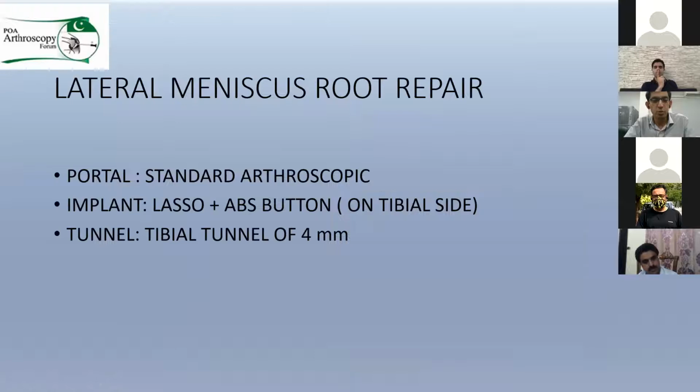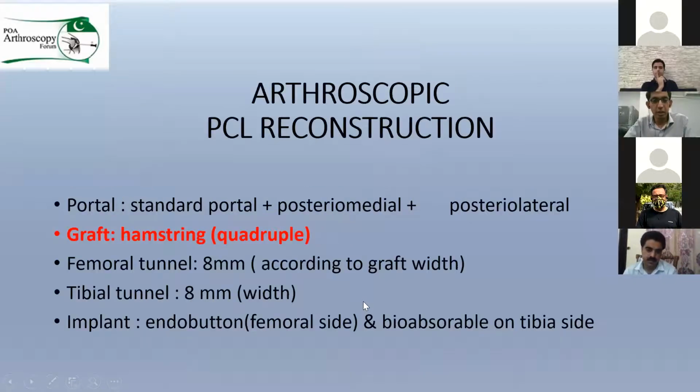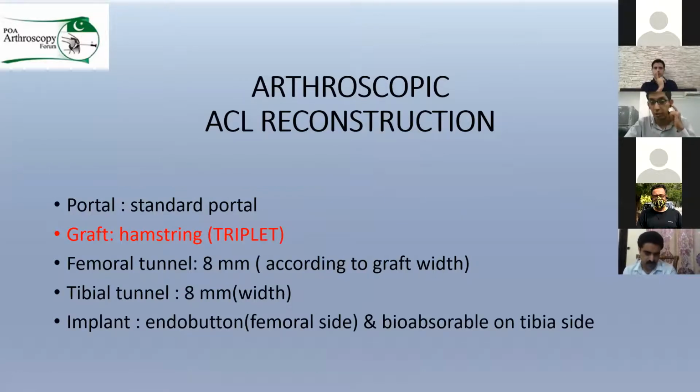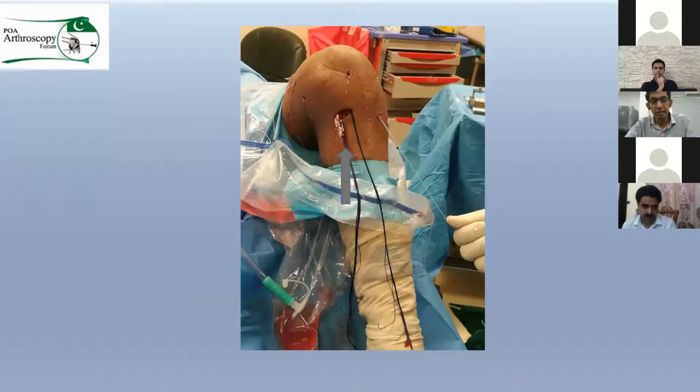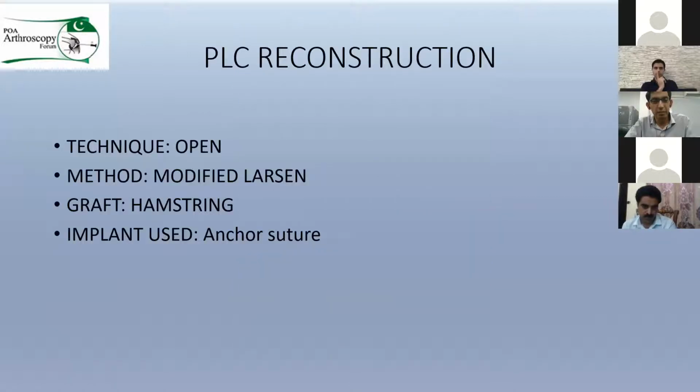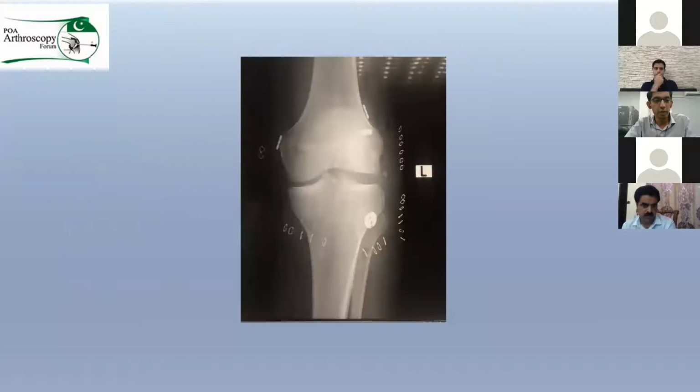So we planned to do the root avulsion fixation first using a lasso, and we used a button outside the patient. We did the PCL with the hamstring quadruple graft, and we did the ACL with a triplet graft because, given the thickness of the tendon, we were lucky to find a good thick tendon. Then these are the tunnels in C. We used divergent tunnels for the PCL. This is fiber wire for the posterior root avulsion fixation. And for the PLC, we again used the Larson loop technique because of the graft.